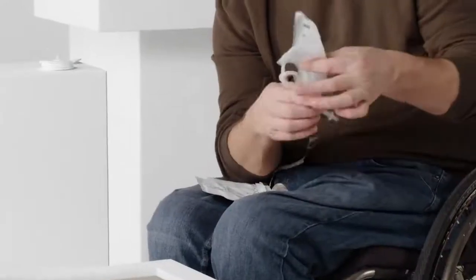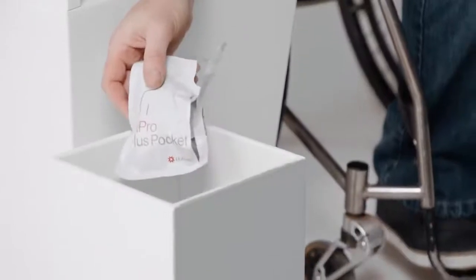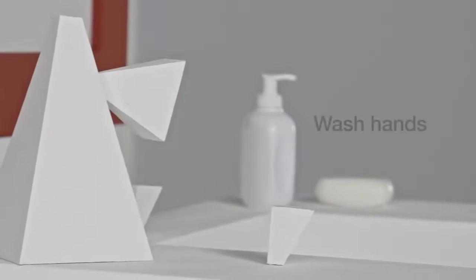Wrap it all up, dispose of it. Easy. Voila. Finally, remember to wash your hands again.